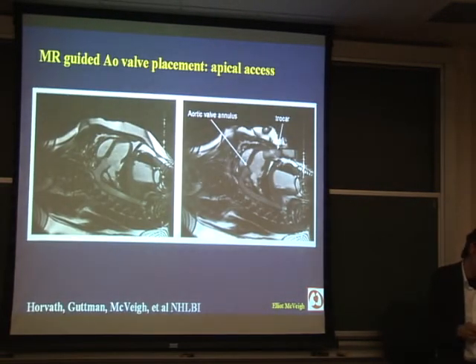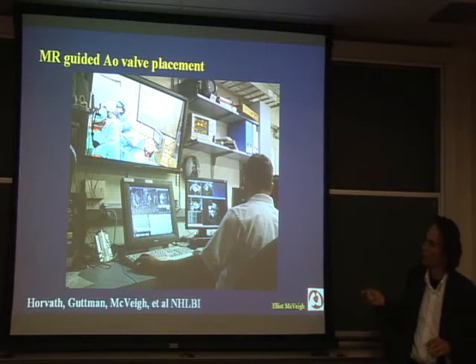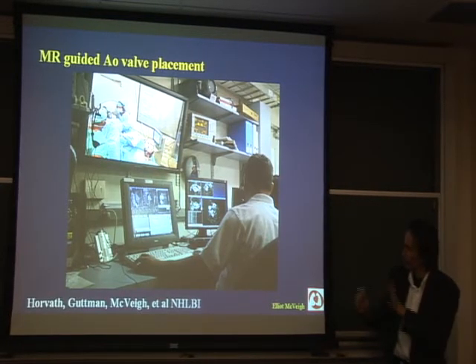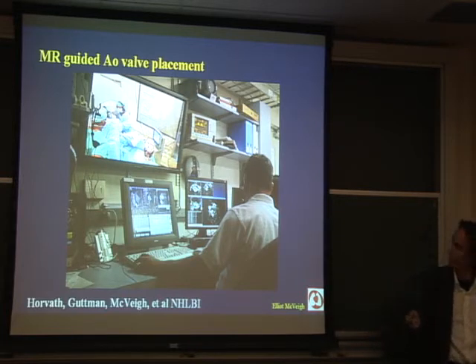And here's Mike, again, driving the system. So he talks to Mike and says, I'll push it a couple of centimeters, or I want to go back to this view, and Mike just obliges and does it in real time. It's fantastic. Voice activation, with no errors. So this is a two-person job.